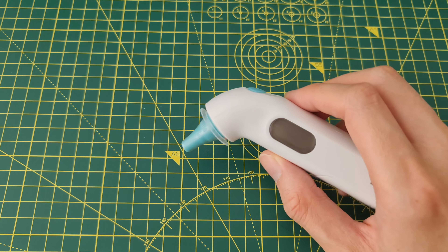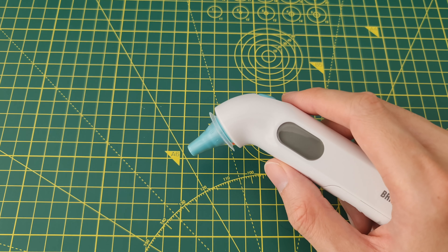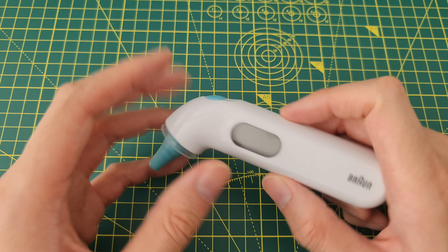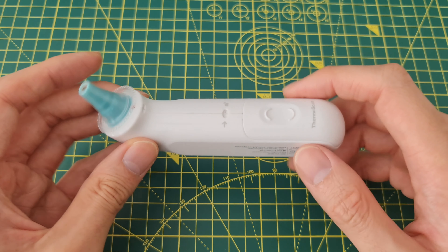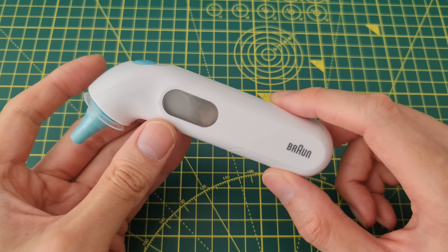What's up guys, today I'm going to show you how to change the temperature display from Celsius to Fahrenheit or vice versa on this Braun thermometer. I think it works for all the single button thermometers that Braun make.